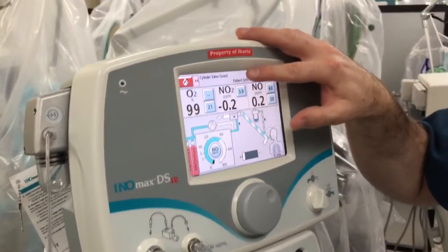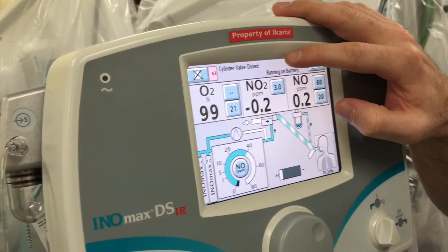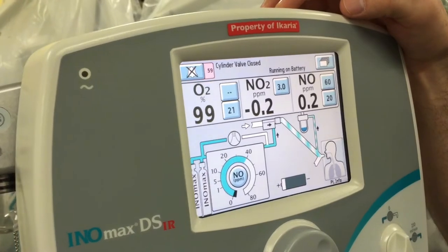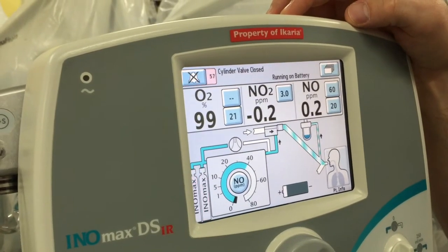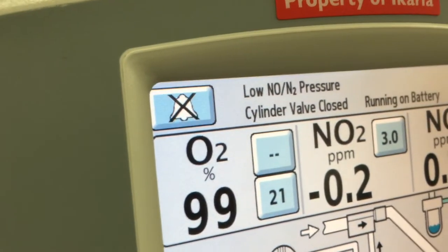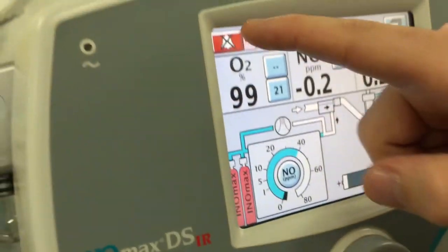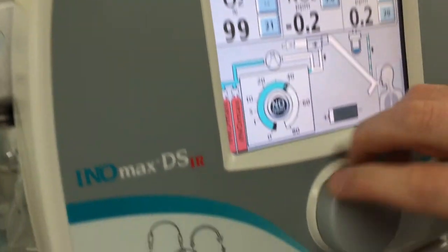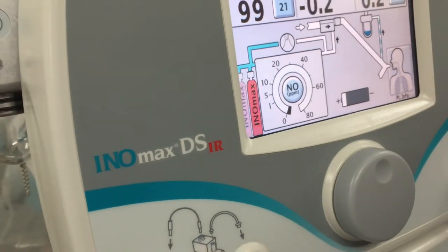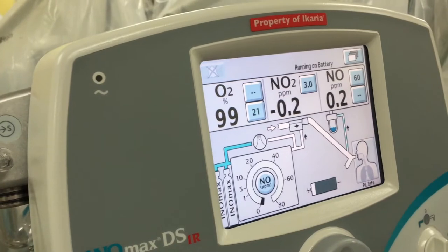What you're looking for on your monitor is the alarm that says 'NO N2 is low.' You'll see it pop up — 'NO N2 pressure cylinder valve is closed.' At this point, go ahead and hit silence, then turn your dosing off and clear out the alarms. That concludes our purge and alarm verification.